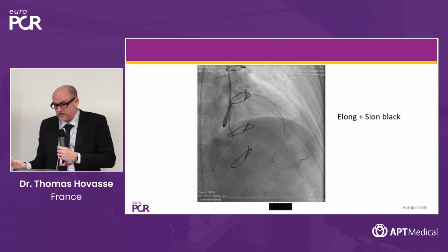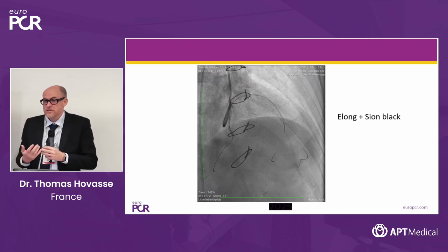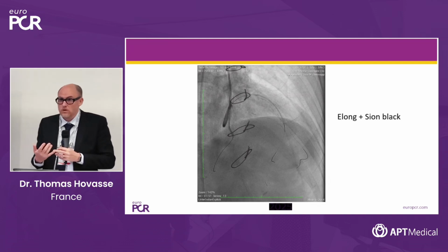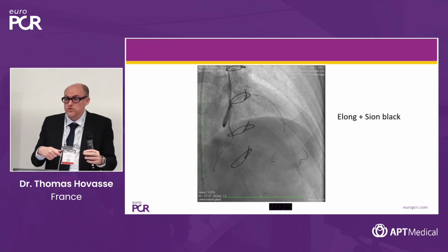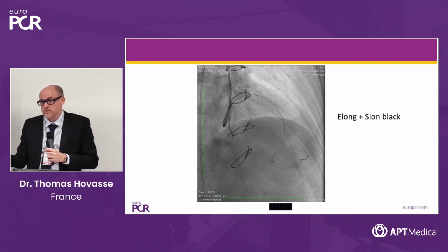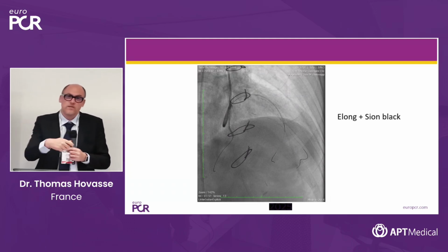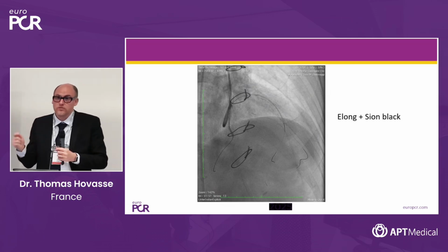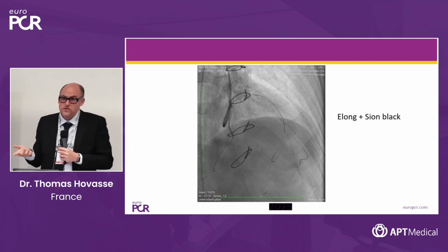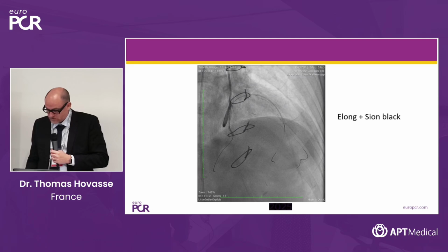micro retrograding. That's why in our cath lab we only have 150 centimeters micro, because it's not very problematic to use them in antegrade procedure, but you can always use them in retrograde procedure. And you don't have to have 135, for example, and say, okay, now I have to go retro, and 135 will be too short, so I have to take another microcatheter. So it's quite expensive if you have to use 2 or 3 micros per procedure.